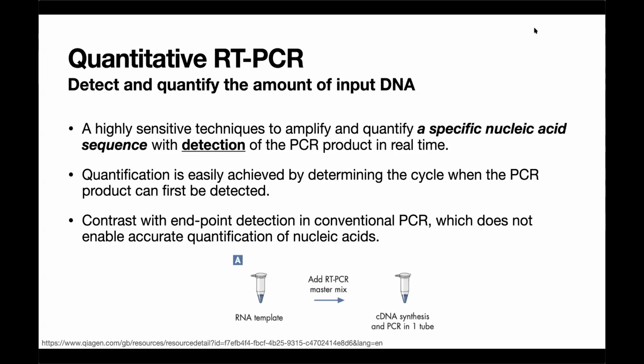And the vast majority of the tests you're likely to encounter as a consumer or a healthcare patient would be based in quantitative reverse transcription PCR, which is actually a very general and very powerful technique to both detect and quantify the amount of input DNA. So the RT step is necessary to convert viral RNA into DNA. So this is reverse transcription.